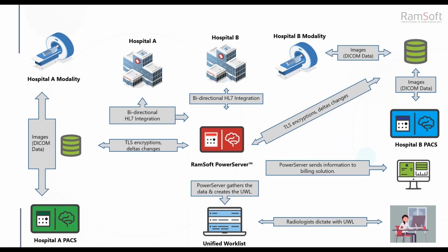The status messaging developed through these HL7 messages provides messaging between the hospital system and your PACS, which enables radiologists to read in either system. So this configuration also prevents duplicate reads, because if the radiologist opens a study in the hospital system, for instance, a message is immediately sent to your PACS, and the same in the opposite direction. It's kind of like a parallel PACS.